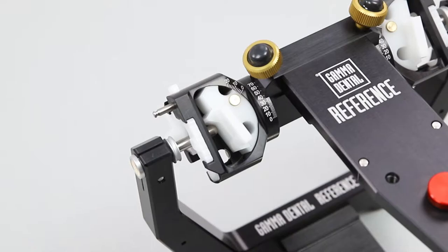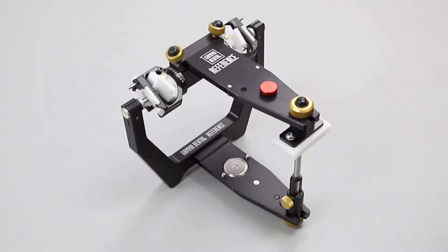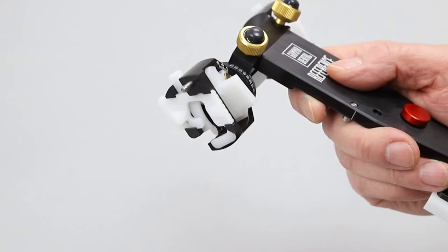Next, we want to focus on the unique and patented condylar housing construction of the Reference SL articulator. In contrary to other articulators, the lower member of the Gamma product is not equipped with a condylar ball. Instead, it is equipped with an axis as a representation of the mandibular hinge axis.